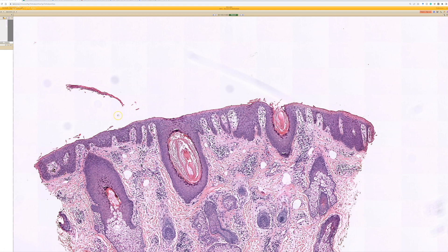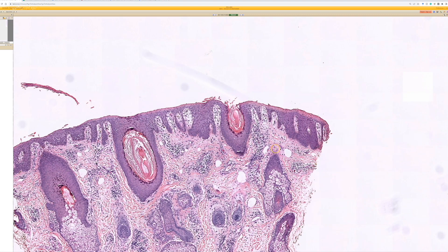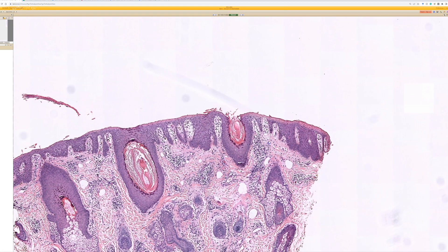When the stratum corneum is completely gone — here we see one flake of it that helps as a clue — but otherwise when it's completely gone, sometimes our brain ignores that fact at first because it doesn't look abnormal. It's missing. Sometimes missing structures are harder for our brain to pick up on than seeing something that's present and abnormal. So sometimes you don't think about it until you're like, wait, where's the stratum corneum?